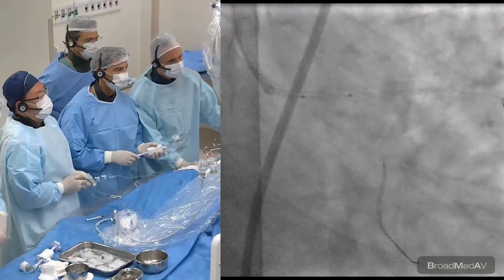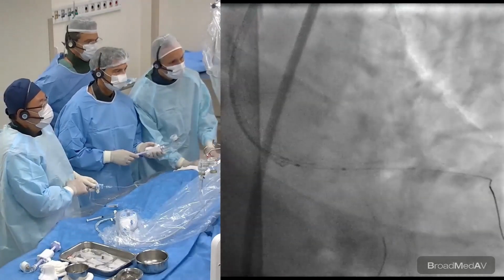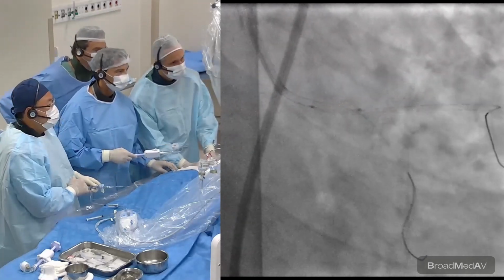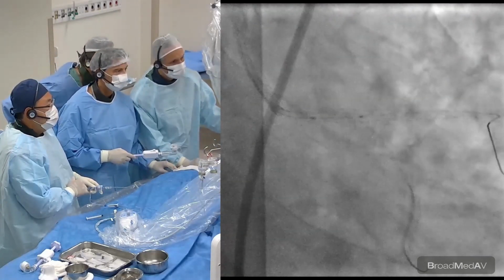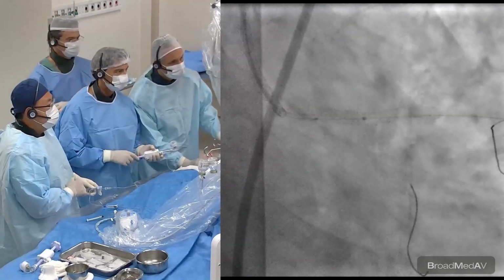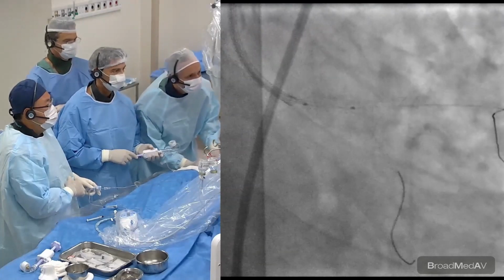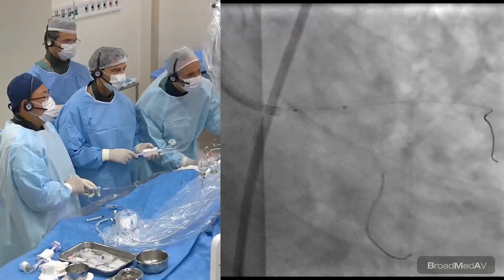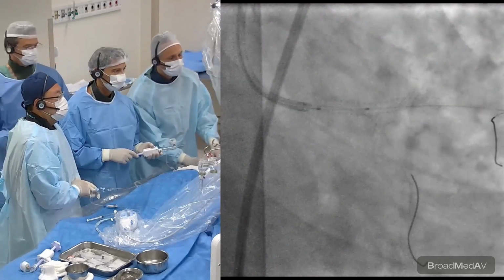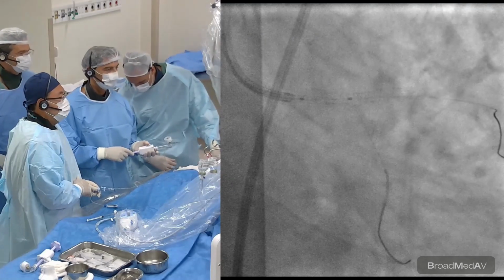Maybe you should go with the guiding catheter a little bit more. Not yet. Yes. Test. Now maybe you film. No, put the guiding catheter here. Okay, now. Test. No. A little bit more. Yes. Could you record, please, Ricardo, just to show people? You can record. I'll film.